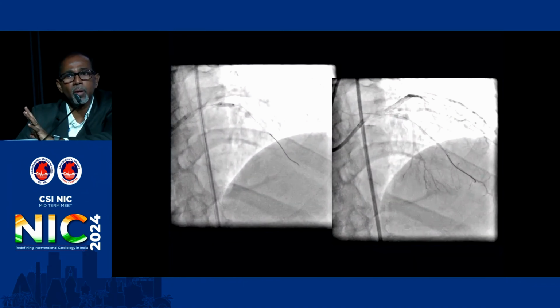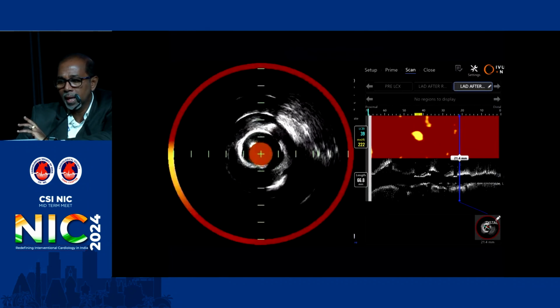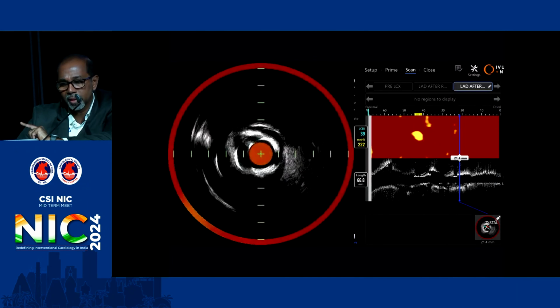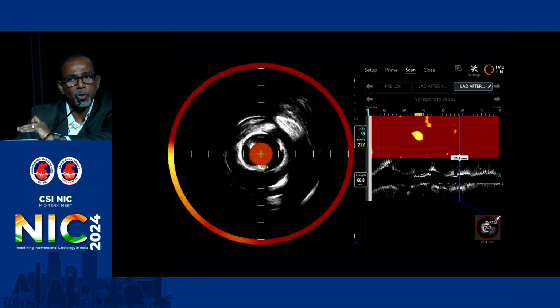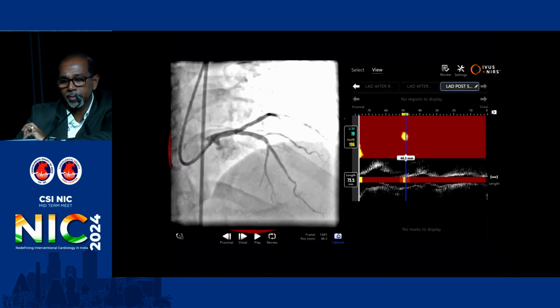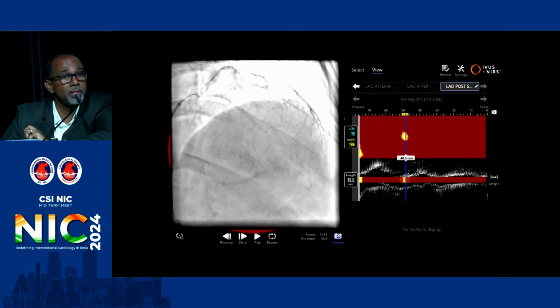So we just went ahead with a non-compliant balloon and we opened it up. And then following the non-compliant balloon, repeat evaluation revealed that there were multiple breaks in the calcification. The amount of lipids had significantly reduced, and finally we went ahead with stent implantation, and that was the final result.